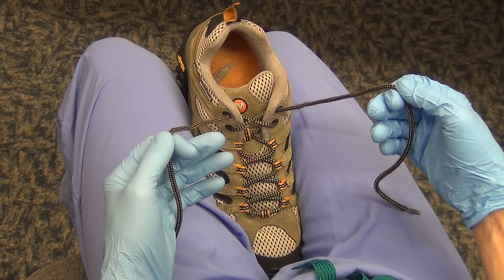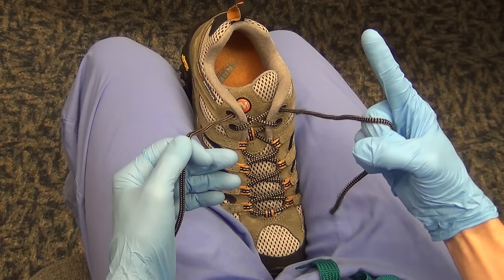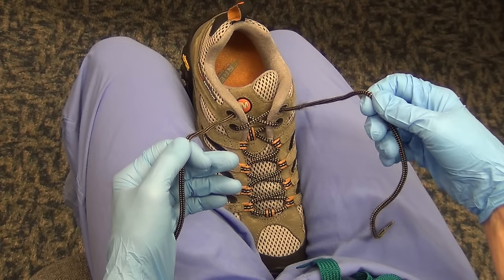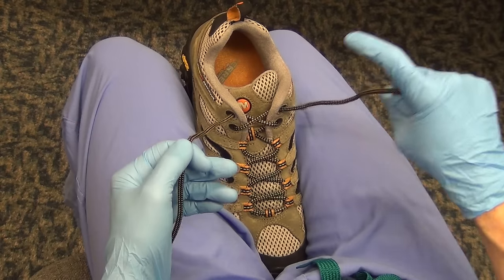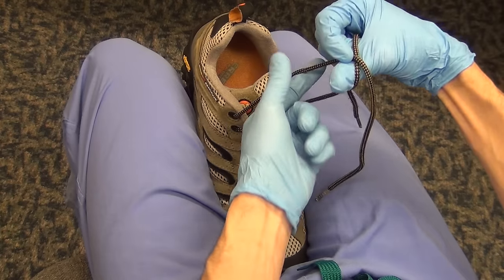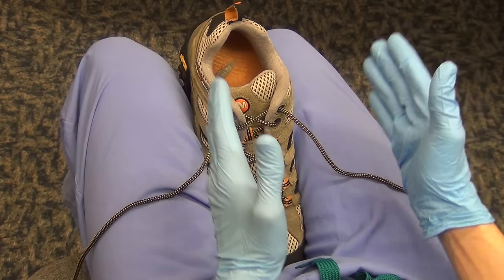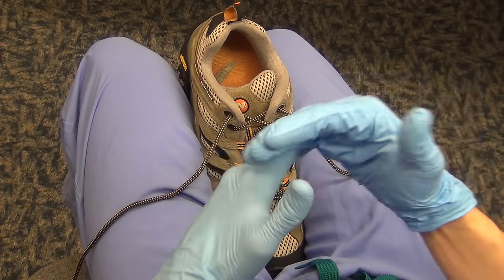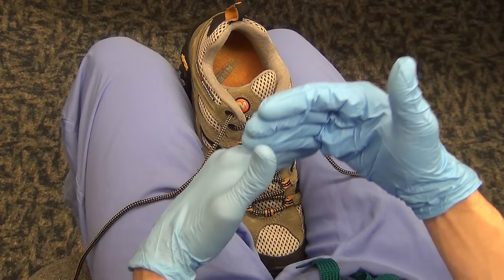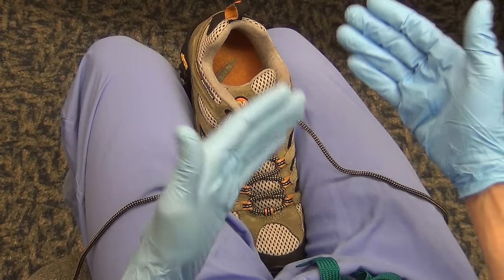For starters we're going to talk about two handed knots. The simple concept here is that you need to learn how to tie around both your index finger and tie around your thumb. You're eventually going to want to make a finger circle and then make what I call the suture circle. We'll start with the index finger, then the thumb, and then alternate back and forth — two flat knots going after each other being a square knot.